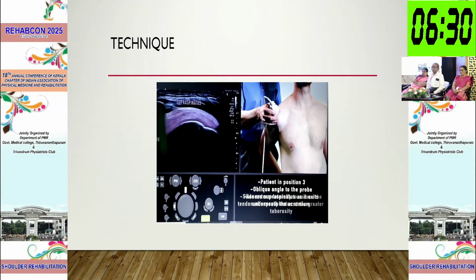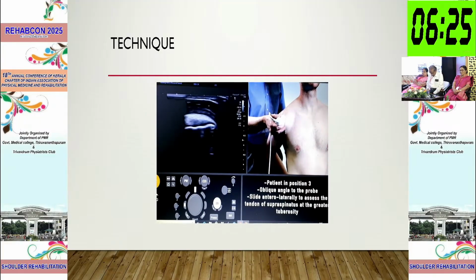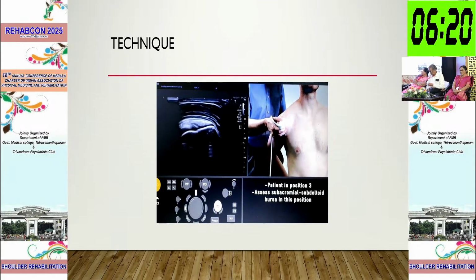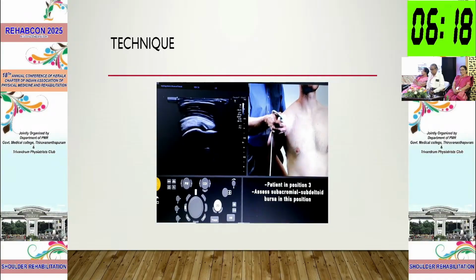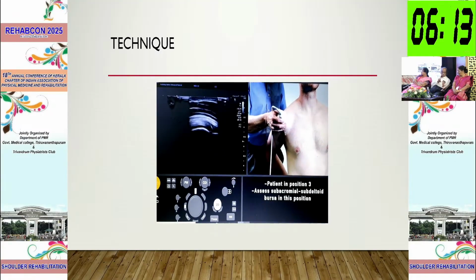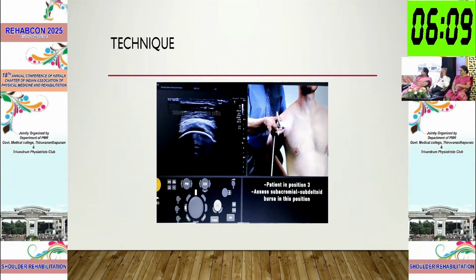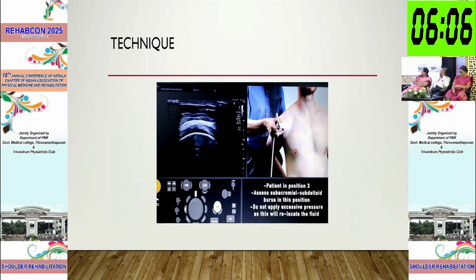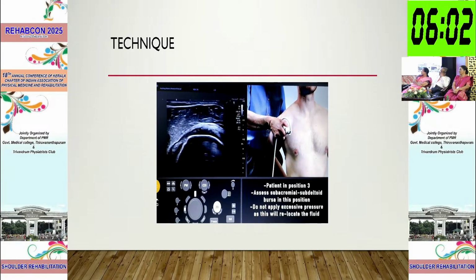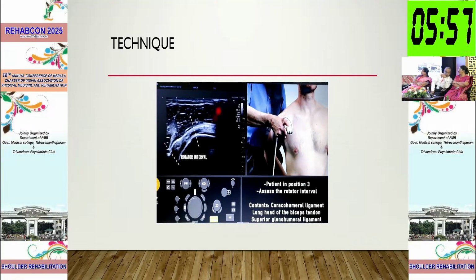And then coming to the most important part, look at the position of the hand. It's going back for the supraspinatus insertion. And the supraspinatus insertion, of course, is the area, within 2 centimeters of the insertion, where about 80% of tears always occur. And there you can identify the subacromial, subdeltoid area. You can see that there's a dark area coming here. The dark area coming, that's the fluid there.